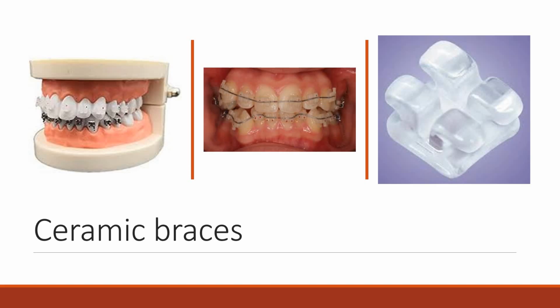A significant disadvantage of metallic orthodontic brackets is their poor aesthetics. Aesthetic bracket systems that are transparent or more closely resemble natural tooth color have therefore been developed. The early aesthetic brackets were made of acrylic and polycarbonate, which discolored quite rapidly and were prone to both permanent deformation and failure. To overcome these problems, plastic brackets were made in polyurethane or polycarbonate reinforced with ceramic or fiberglass fillers. Ceramic brackets were introduced in the 1980s and provide higher strength, more resistance to wear and deformation, better color stability, and superior aesthetics. They are manufactured from aluminum oxide, and are described as either mono or polycrystalline, dependent upon whether they are made from one or many crystals.